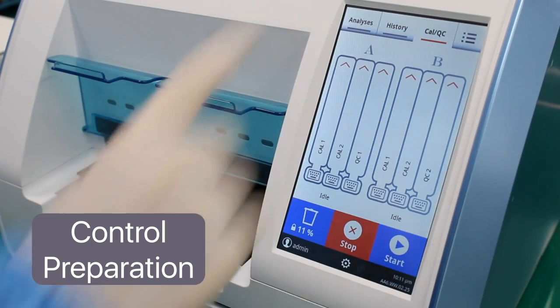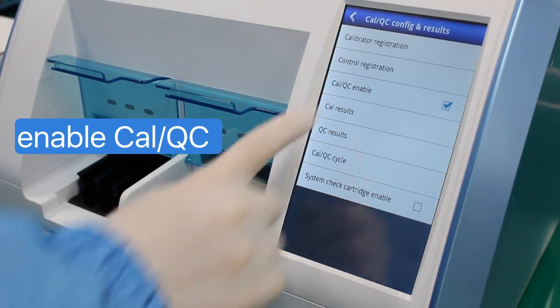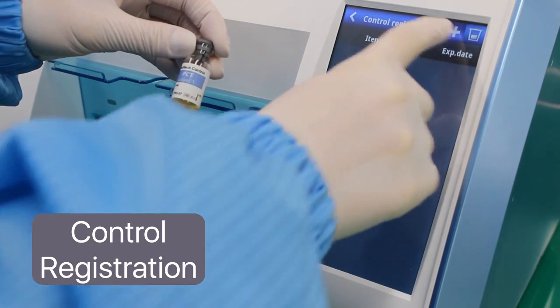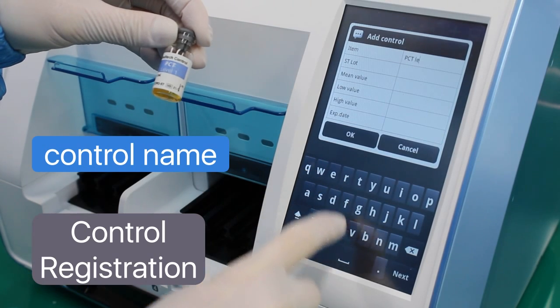On the CalQC settings, check CalQC enable, then press Control Registration. Press the plus icon at the upper right-hand side of the screen to add and register the control level.